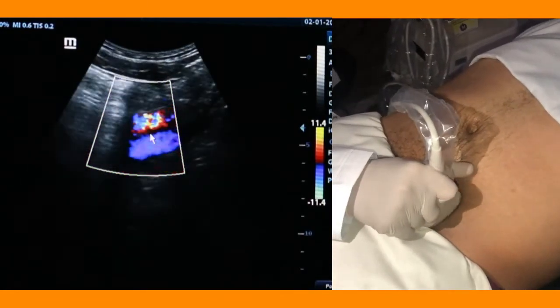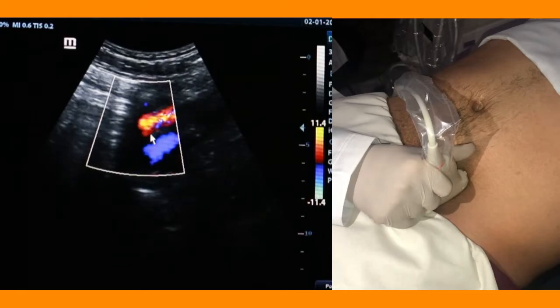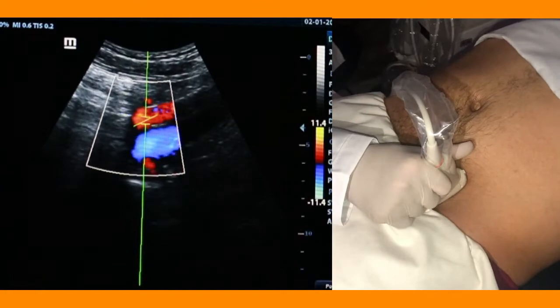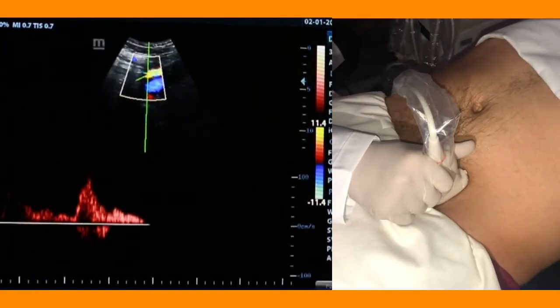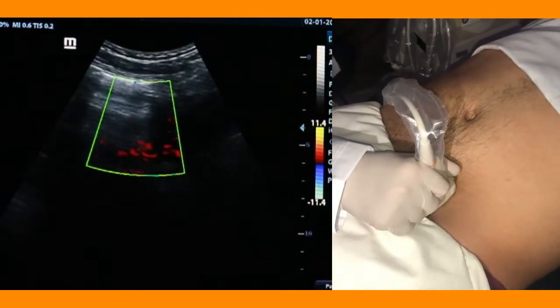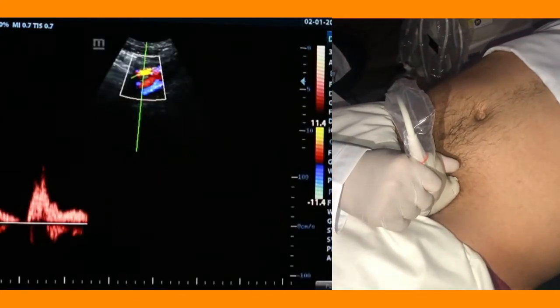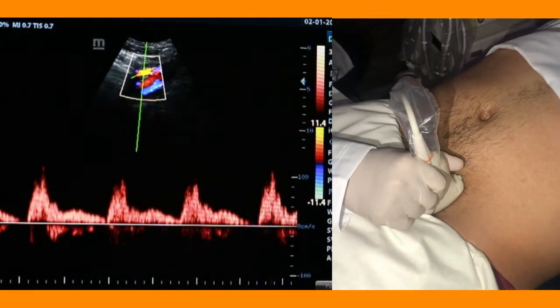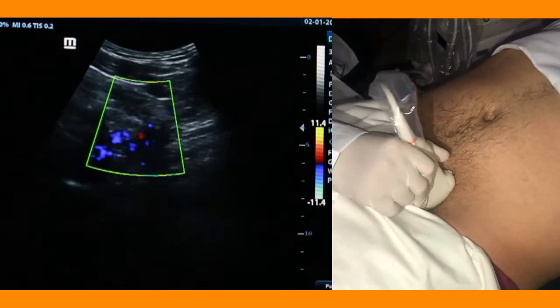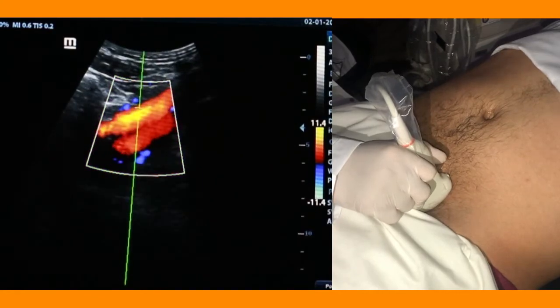You can make a longitudinal study. If there is no gas, you can apply the spectral analysis here. We'll check the type of waveform. By the type, you can know whether this is normal or abnormal. This is an artifact, don't worry. Try to adjust your hand again, like that. Here, we can see this is considered abnormal. No. You should check your technique, 1, 2, 3, until 4 times or 5 times.